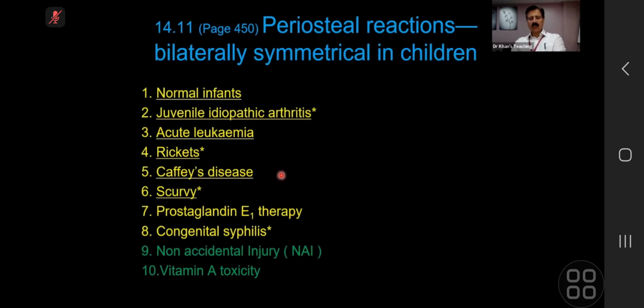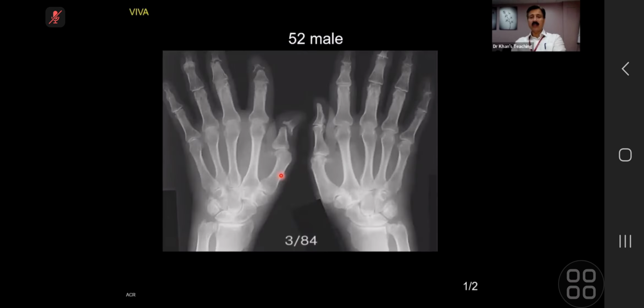So we will now take, let me, candidate 2, I'll give you one more film, which is this film, and then we will take a 5-minute break. Candidate 2.